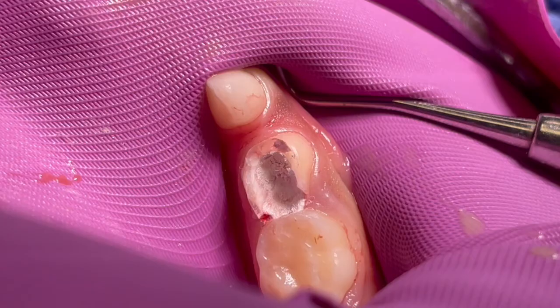Going back to the IFUs: use the applicator of choice to apply Neoputty on the exposed pulp or the floor of the cavity preparation, maintaining a minimum thickness of 1.5 millimeters. Excessive material may be removed using a cotton pellet slightly dampened with sterile water or saline. I would avoid over-moistening your pellet because you're going to wash out some of that Neoputty product.